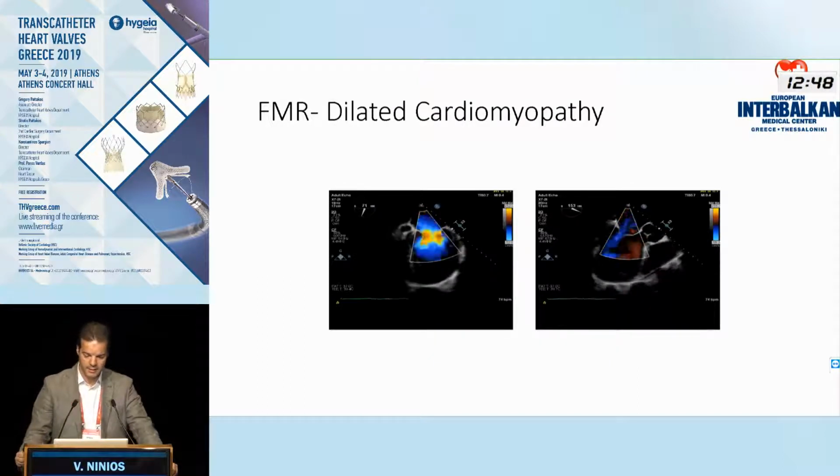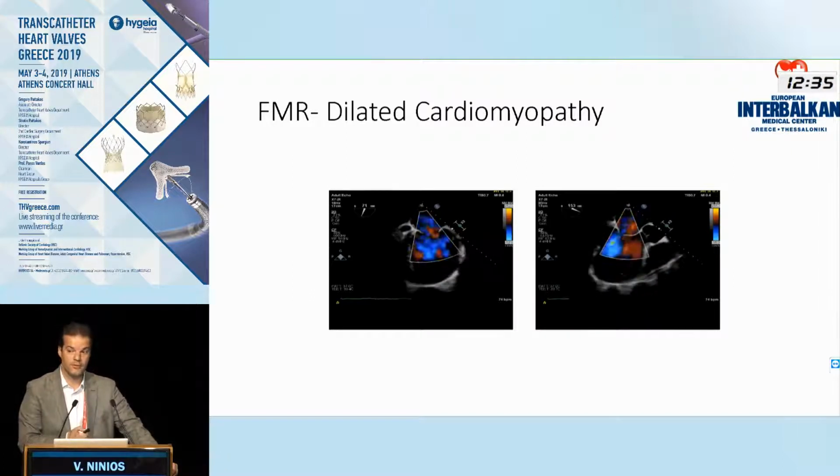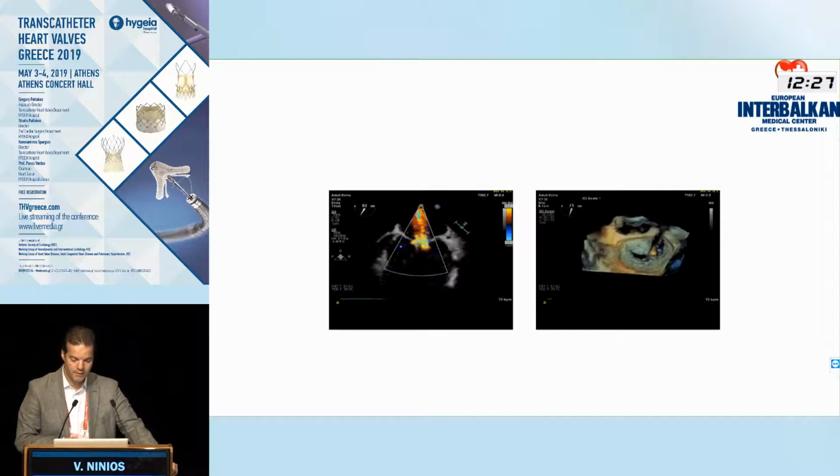Now, this is another case. This is a more balanced situation. Commissural view, central mitral regurgitation, two jets that collide with each other. You see they combine. So actually there's one broad jet, much broader than the previous one. So that might be a predictor. Clearly in the X-plane, we can see that there's a severe mitral regurgitation. This is the effect of one clip.